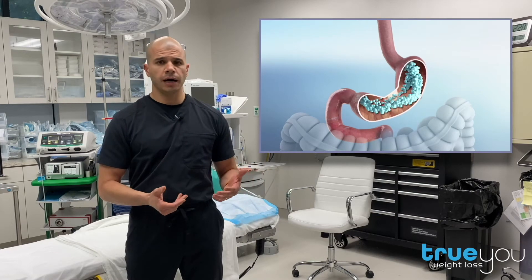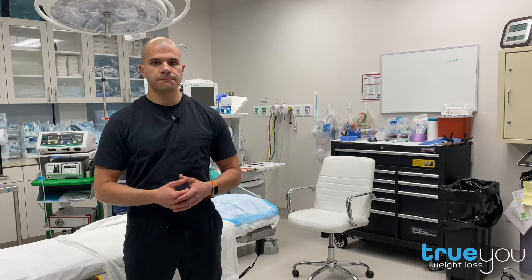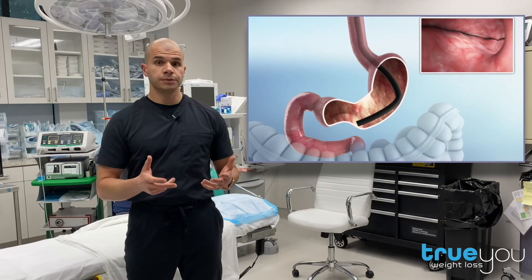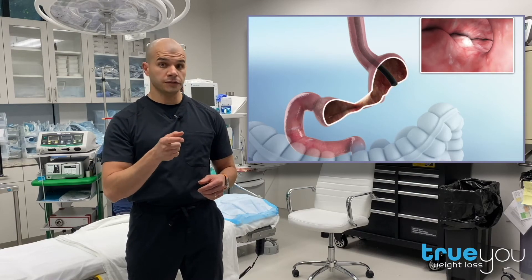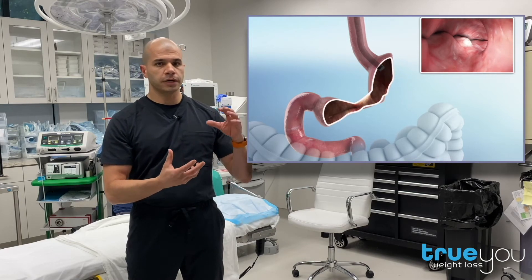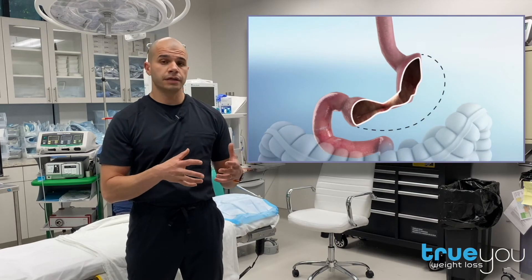And until now, there really wasn't a great option to address this other than major surgery, which carries significant risk. However, we now have the ability to endoscopically tighten a stretched-out sleeve. During this 15 to 20-minute non-surgical procedure, we are able to tighten the stomach from the inside using an endoscopic suturing system. This device allows us to place stitches from the bottom of the sleeve to the top of the sleeve, thereby making it much narrower and even shorter. So the end result is a sleeve that is as tight or tighter than it originally began.